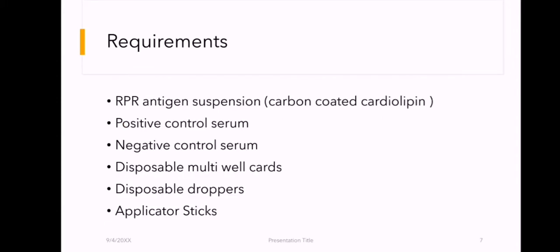Requirements needed for this test are: RPR antigen suspension, which is carbon-coated Cardiolipin; positive control serum; negative control serum; disposable multiwell cards; disposable droppers; and applicator sticks.